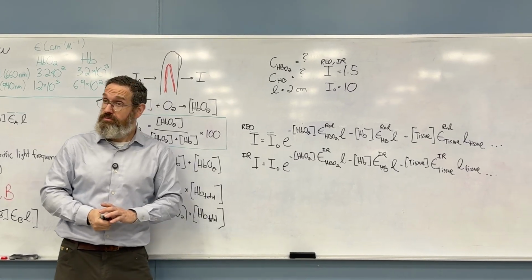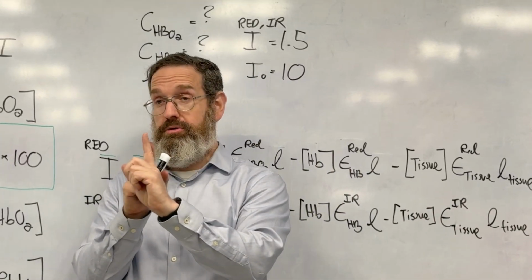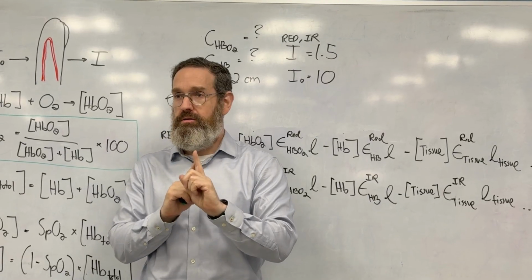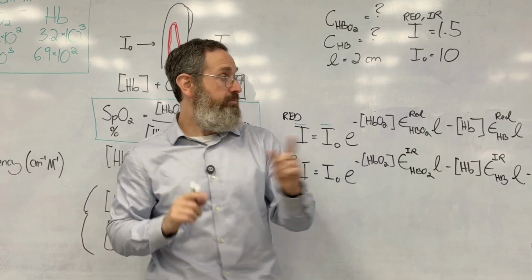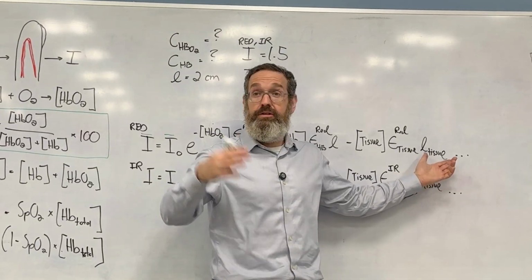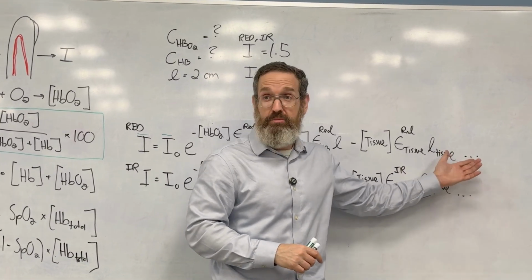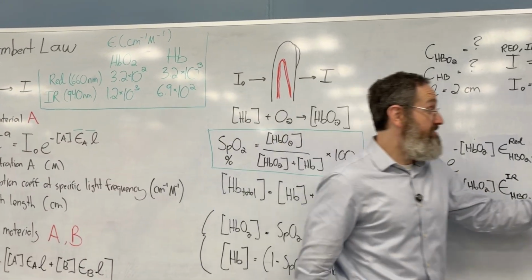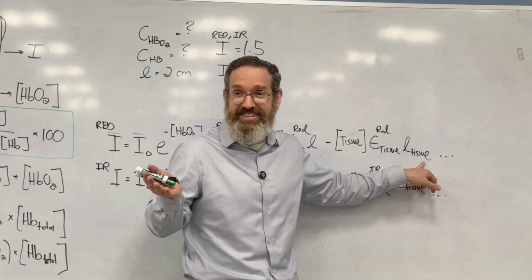And it's even worse, because this length varies. You have to factor in the bone, but even if my finger was 2 centimeters, the bone might be 1. But on Emily's, the bone might be 0.75. And my fat might be 3 millimeters, but on Emily's might be 2 millimeters. And my skin might be 4 millimeters, and Emily's skin is 6 millimeters. So I even have that issue. But not only that, I don't actually know what Emily's skin thickness is.